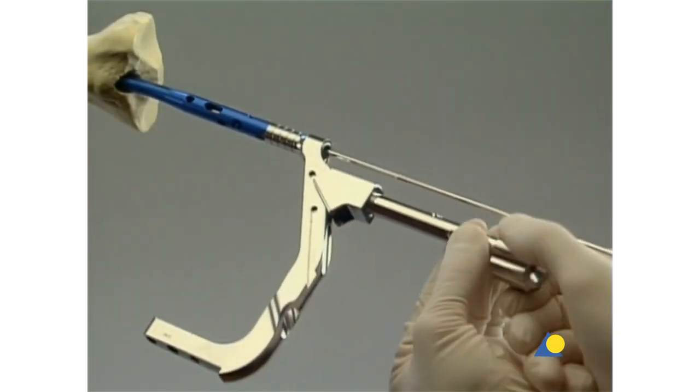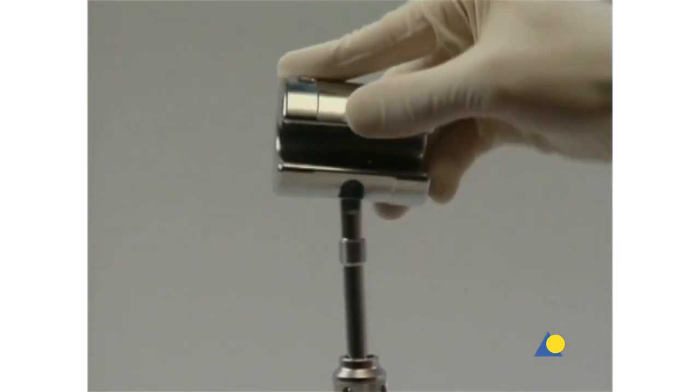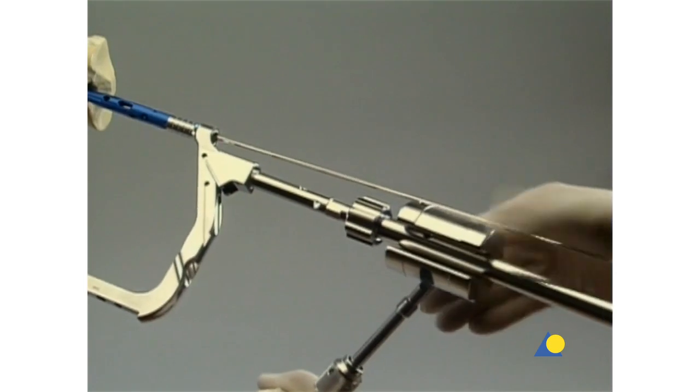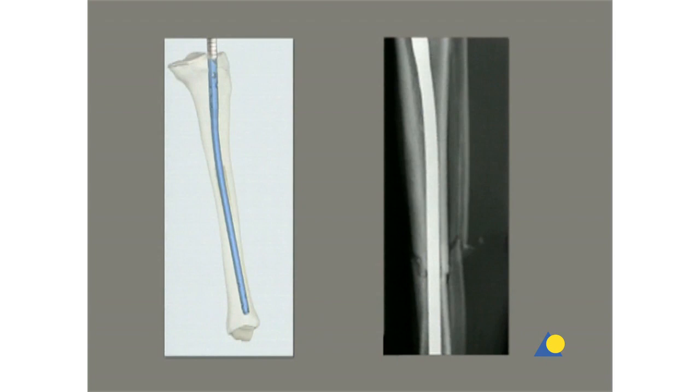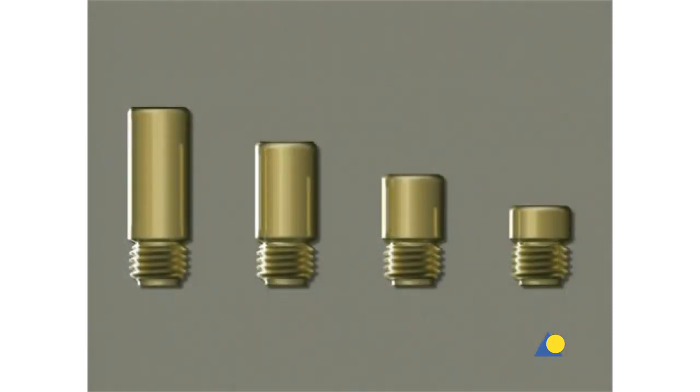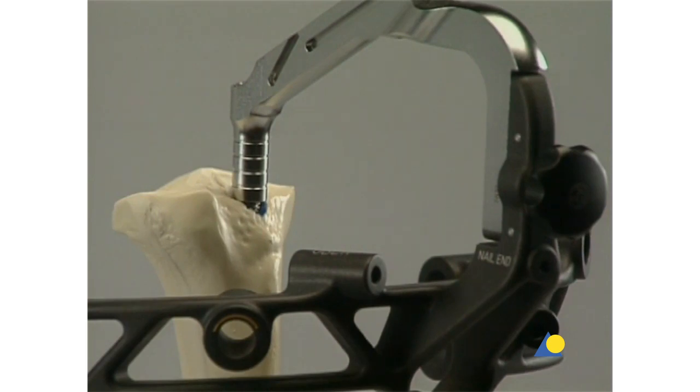The connector is secured to the insertion handle, and the hammer is used in the fixed mode. If more insertion force is necessary, the hammer guide is attached to the connector and the hammer is used in the sliding mode. The final position of the nail is verified in the AP and lateral views with the guide wire placed in the aiming arm. The insertion handle is marked in five millimeter increments corresponding to the extensions of the end caps, and can be used for over-insertion or correcting nail length. If primary compression or secondary dynamization is planned, it is recommended to over-insert the nail up to seven millimeters, which corresponds to the maximum distance between the static and dynamic modes.